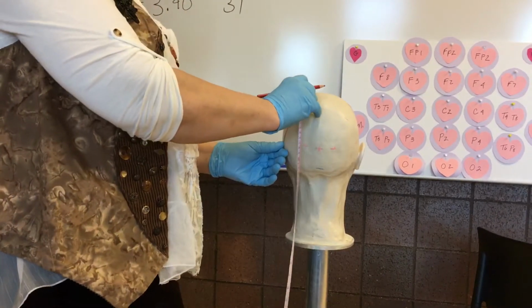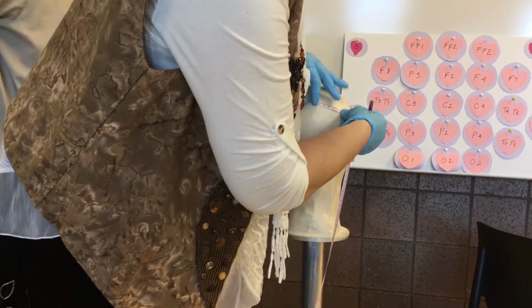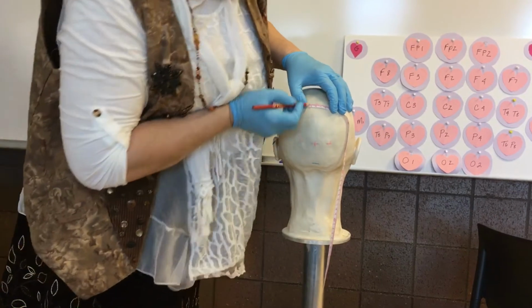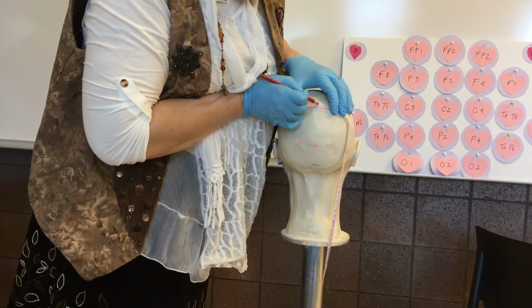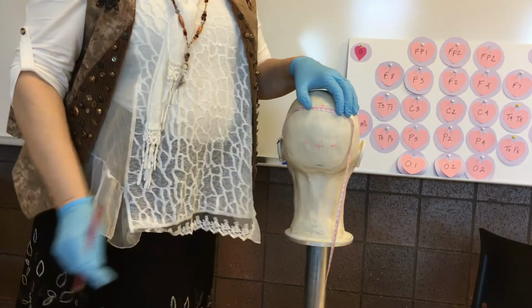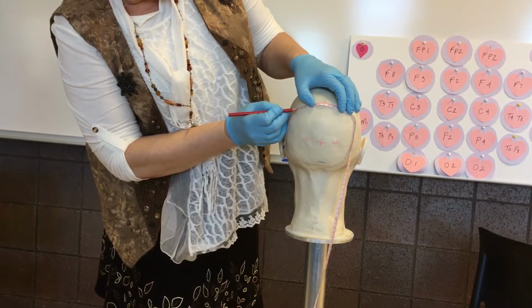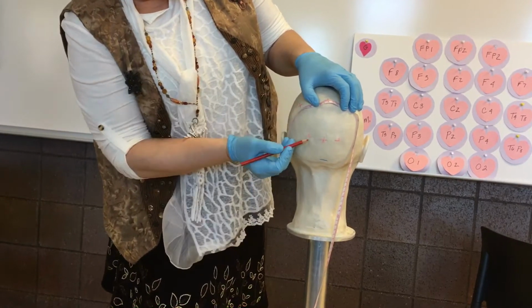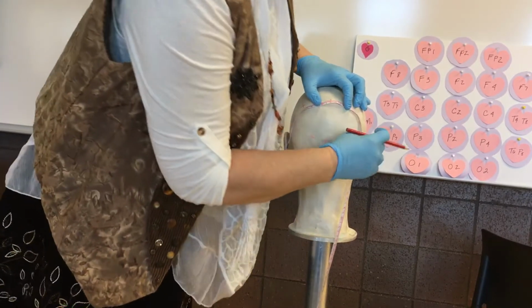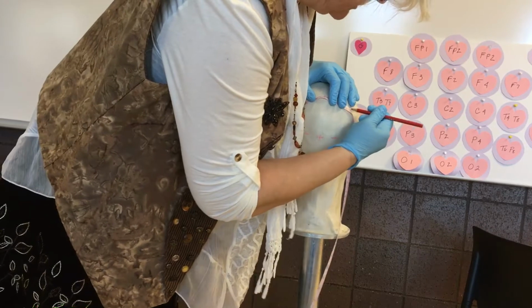Put the 0 here, go behind this one. I get 24. What's half of 24? 12. Does this look like it goes with that one? Yep. Okay, so what's half of 12? If I cross this one, does it look like it goes in line with that one and that one? I can go with 6, 12. What's this one going to be? 18. That math is easy, isn't it?